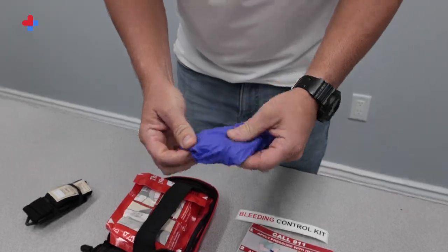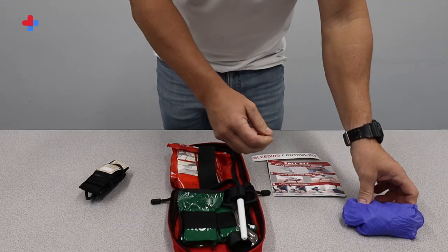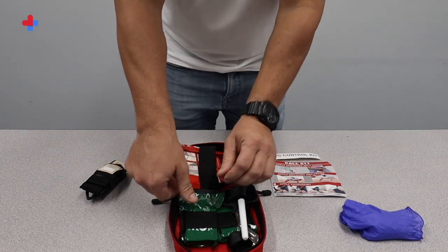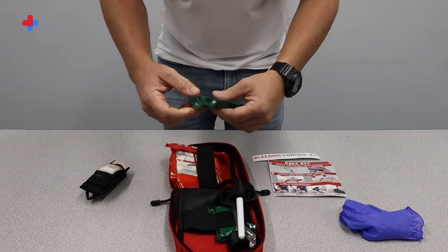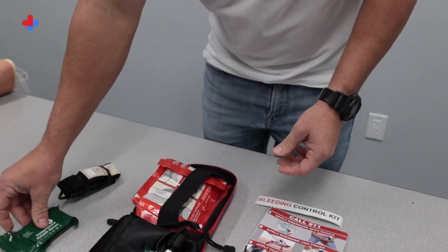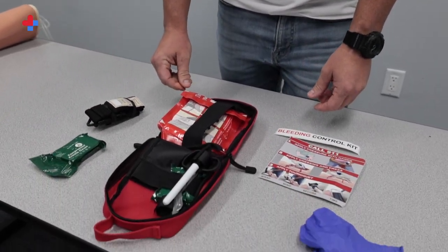Two pairs of nitrile gloves are provided for personal protective equipment. Before you help the victim of a bleeding emergency, put on gloves for your safety. All gloves are one size fits most. Two packs of compressed gauze, which are ideal for wound bandaging and wrapping injuries, are also included.